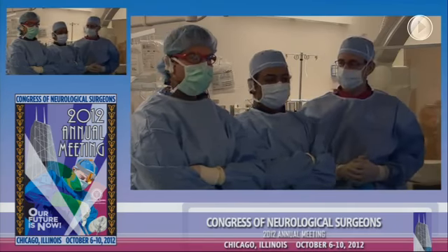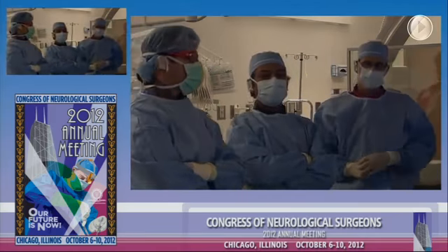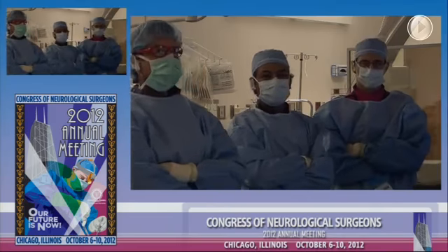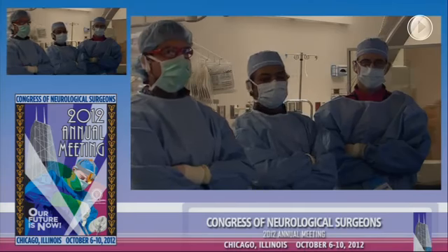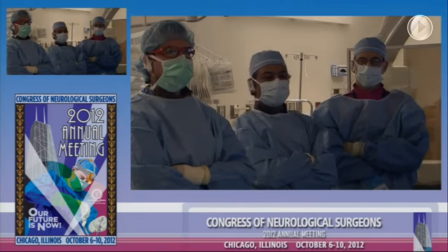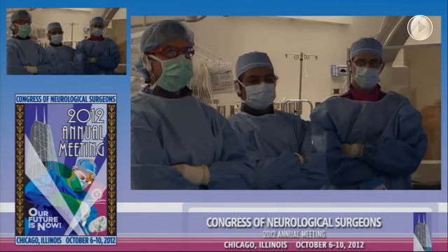Adnan, what are your thoughts? So I think from our standpoint, when we look at our own data that we have published on paraclinoid aneurysms, we are able to endovascularly treat these with extremely low morbidity and mortality without need for secondary cervical exposure, without need for optic nerve decompression.